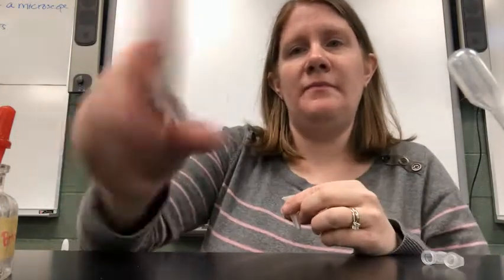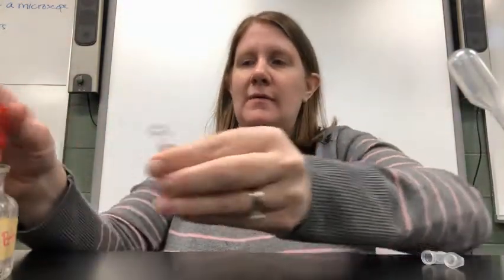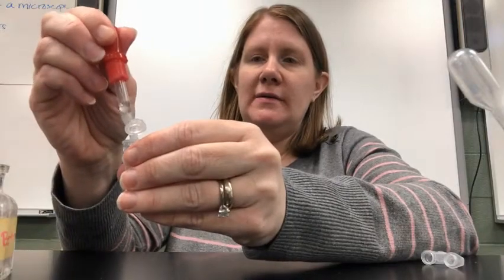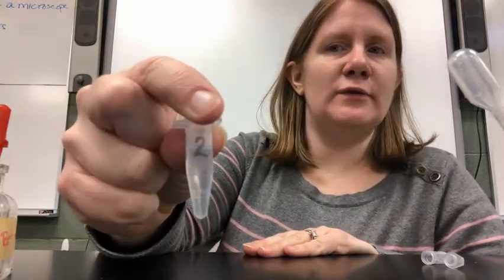Invert it. Put the testing solution in there. Invert it again. And there we have the results for suspect 2.